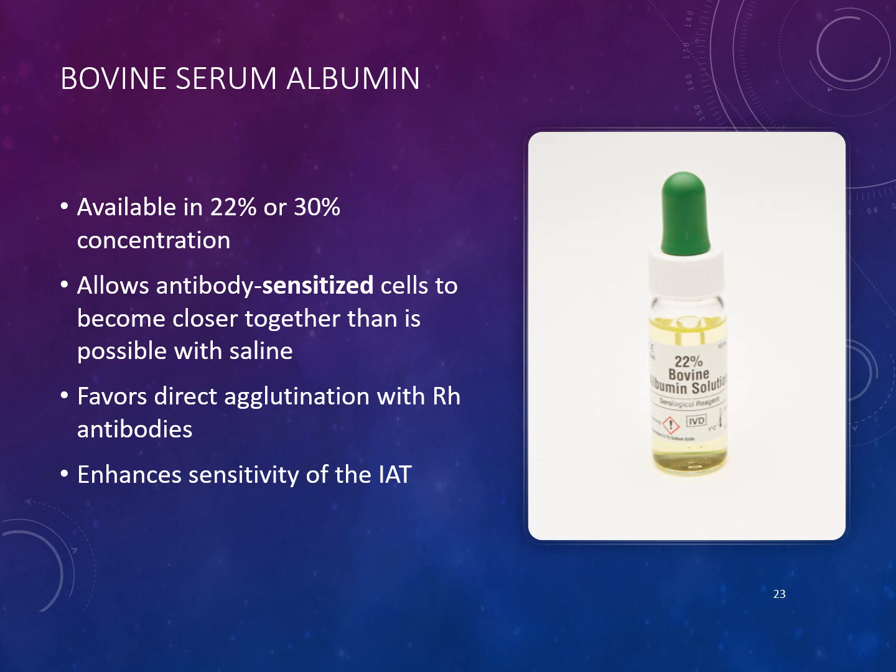And as I previously mentioned, once the red blood cells have been sensitized and coated with those antibodies, it allows them to draw a little bit closer together. It favors direct agglutination with Rh antibodies, so it helps when you're trying to enhance any potential Rh antibodies that could be present, and it enhances the sensitivity of indirect antiglobulin testing. So when we're doing that antibody screen, antibody ID, any sort of crossmatch or antigen typing.